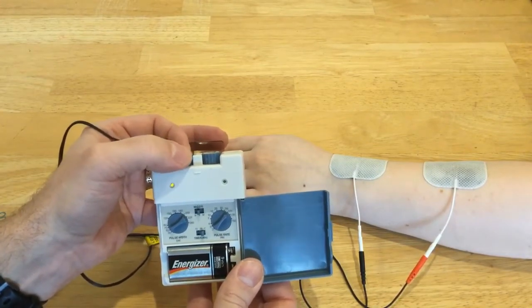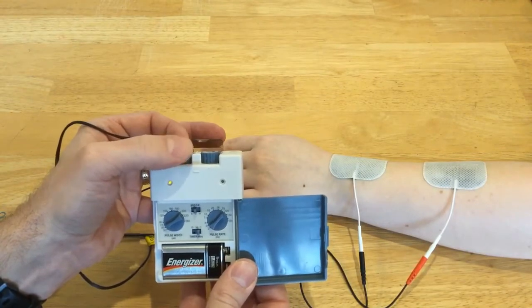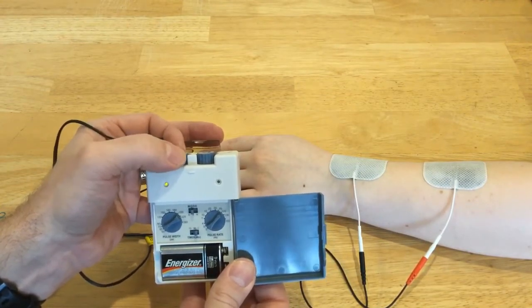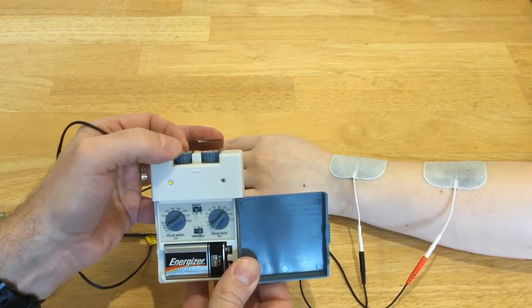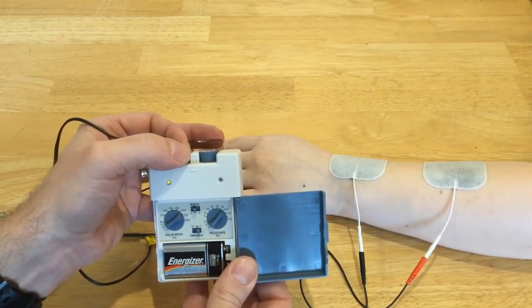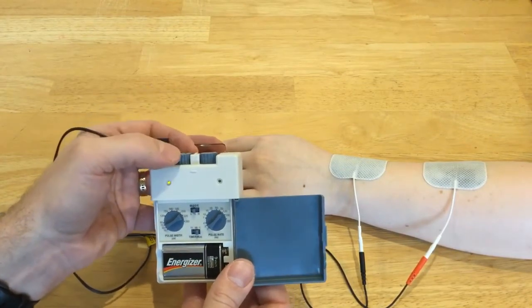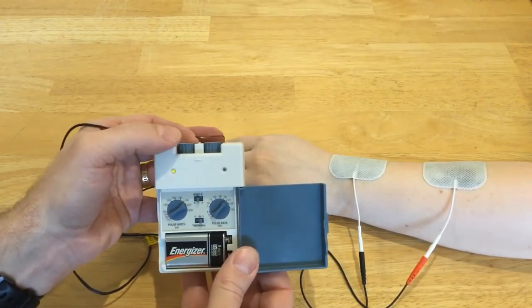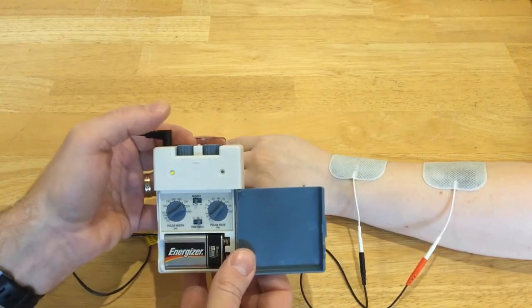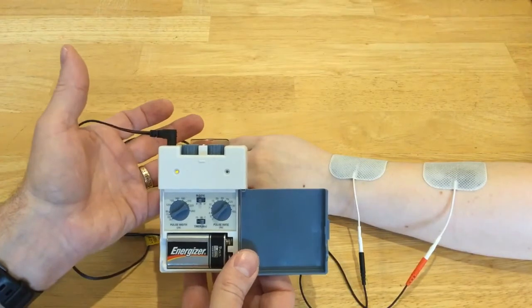So I'm going to gradually turn up the intensity here, and just let me know when you feel something. I feel something. Okay, and what does it feel like? Just tingling. Okay, so she has a tingling sensation. And is it really intense or kind of mild? Mild. All right. And so she has a mild tingling sensation, and that's basically conventional TENS.